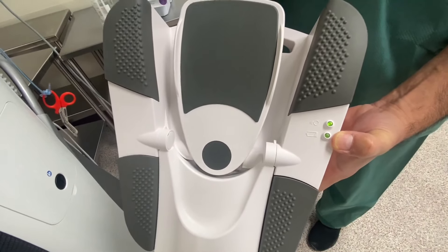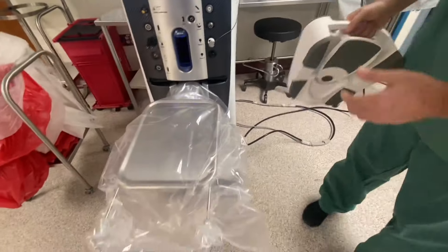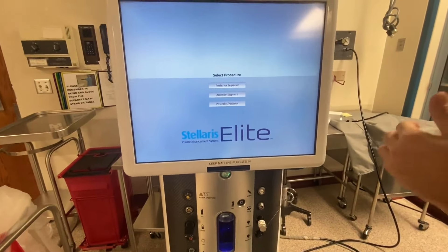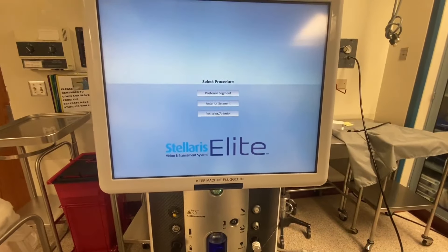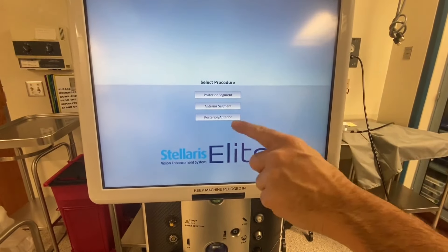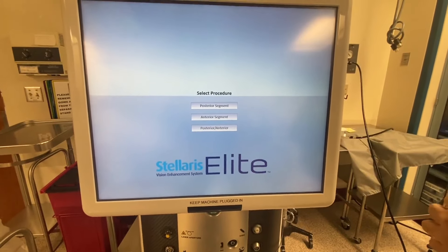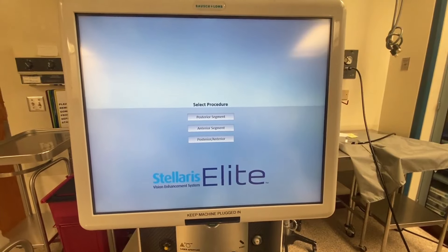The lower indicator is a battery indicator and the upper is a signal indicator. Now we can hit close and select our procedure. There are posterior segment procedure, which is a retina case; anterior segment, which is a cataract case; and posterior anterior procedure, which is a combined facovitrectomy case. Different cases require different matching cassettes. In this video, we are going to show you the posterior only case.